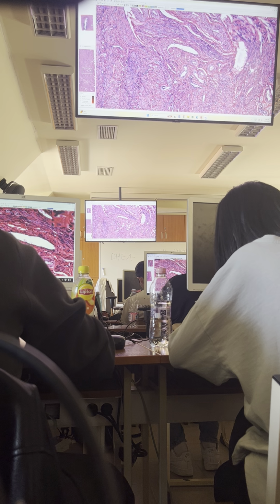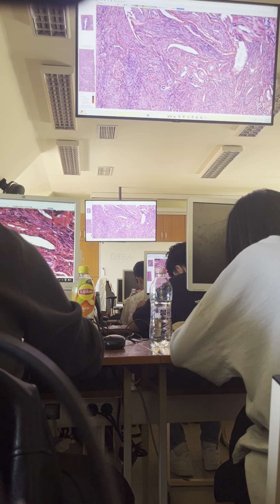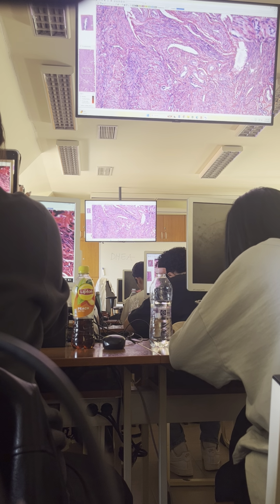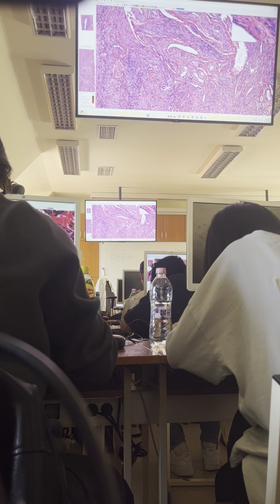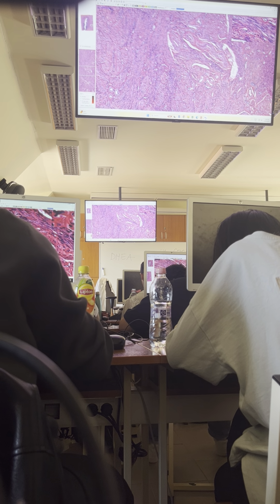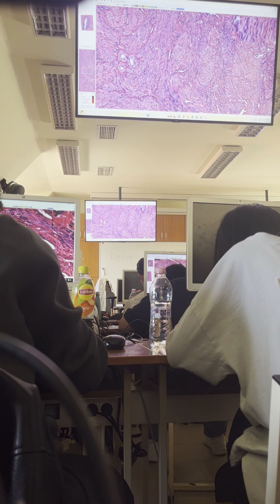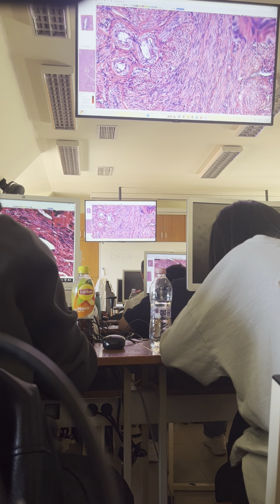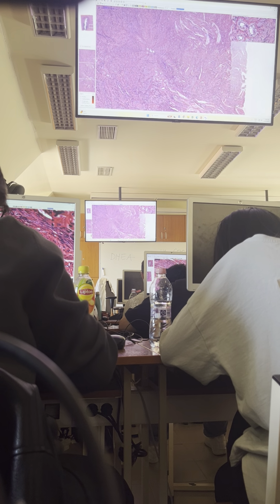So the myometrium is generally full of smooth muscle cells, and this population of smooth muscle cells continuously gets into the tunica media of the blood vessel. That's a kind of characteristic feature here, that there is no sharp border between the tunica media of the vessel and the rest of the myometrium. Okay.